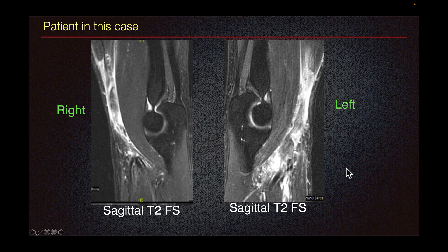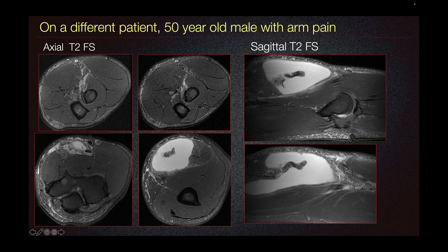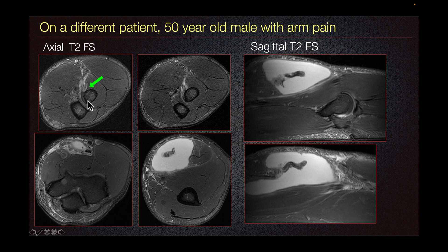To visualize this, this is a different patient — a 50-year-old male with arm pain. In this patient, we have axial T2 fat-sat imaging at the level of the radial tuberosity. In this location, we should expect a hypointense or dark line inserting at the radial tuberosity, which is the biceps tendon.